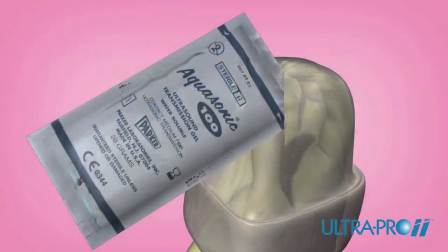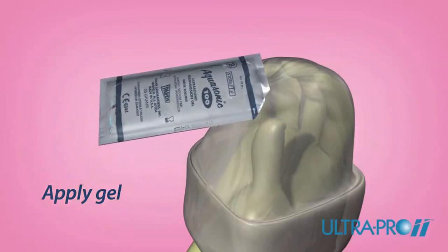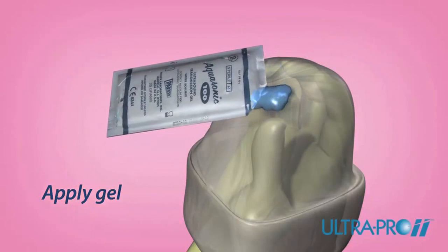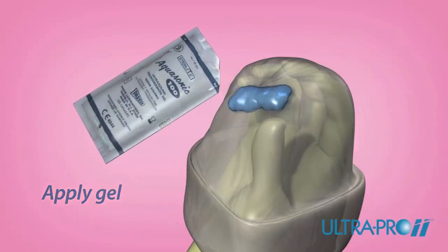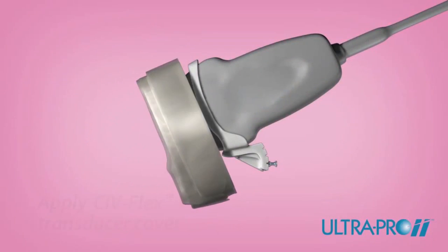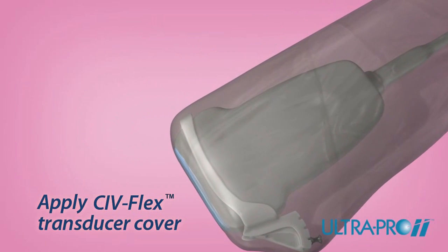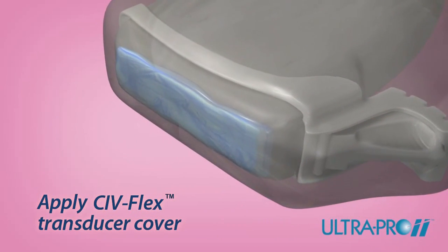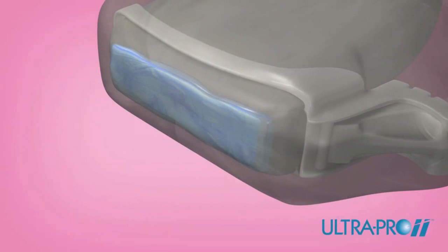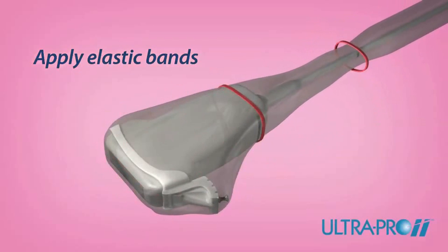Open the sterile gel packet and apply gel to the inside of the CivFlex transducer cover or directly onto the array of the transducer. Apply enough gel to entirely cover the face of the transducer. Place the gelled CivFlex cover over the array of the transducer and extend the cover over the length of the cord, ensuring sterile technique. Carefully remove any air bubbles that appear between the transducer face and the cover. Apply the enclosed sterile elastic bands to secure the cover in place.